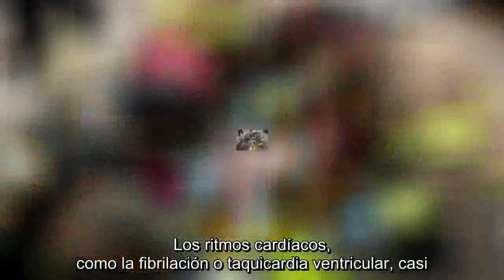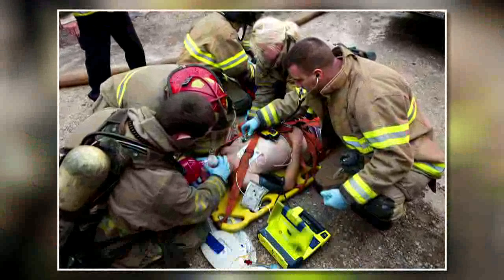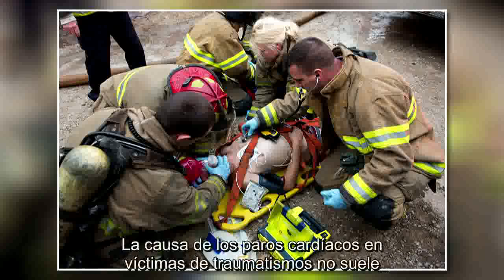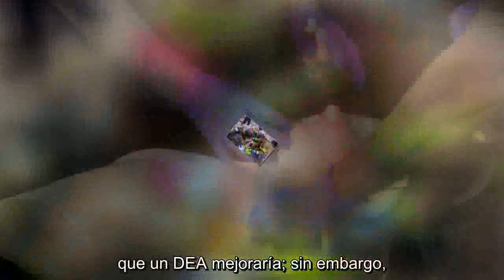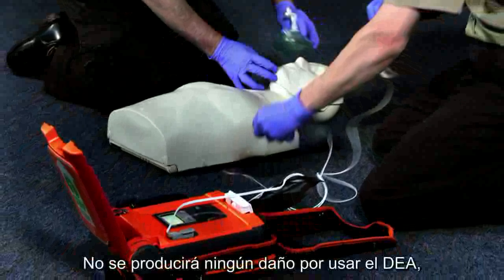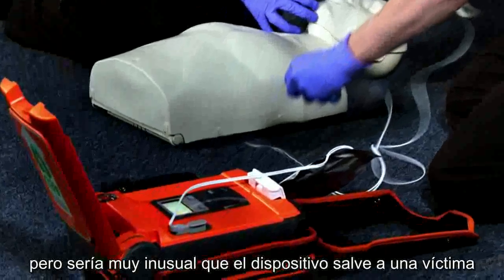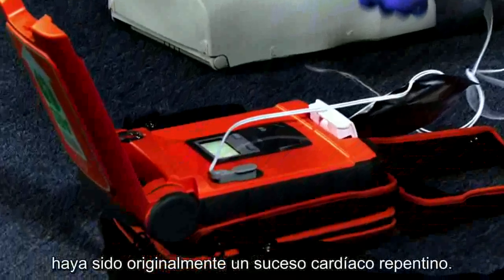Cardiac rhythms like VFib or VTach are rarely present in cardiac arrest from trauma. Trauma victims need immediate transport to a trauma center. The cause of cardiac arrest in victims of trauma is not usually associated with the kind of heart rhythm that would be helped with an AED. However, when in doubt, it is better to use the AED than not. No harm will be done by using the AED, but it would be highly unusual for a trauma victim to be saved by the device unless the cause of the trauma was originally a sudden cardiac event.